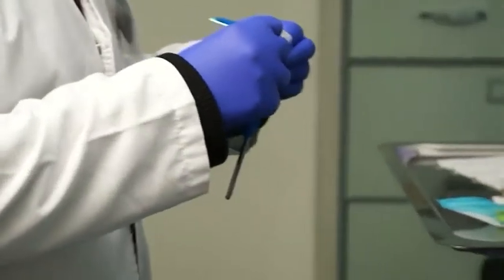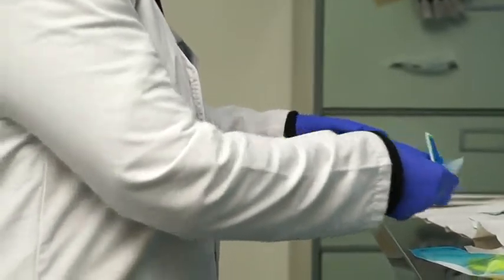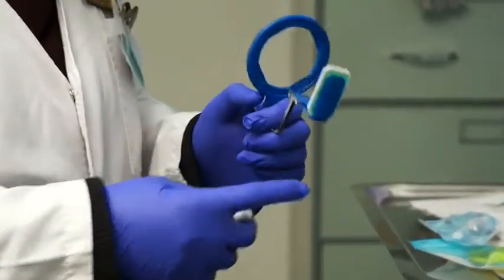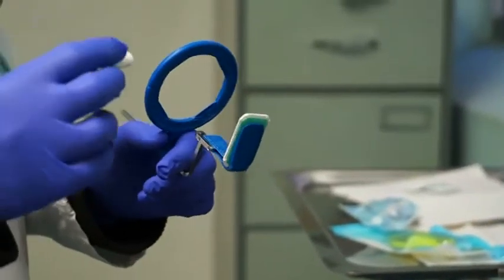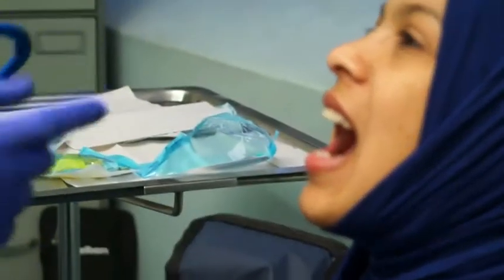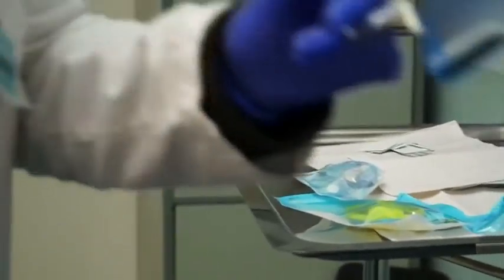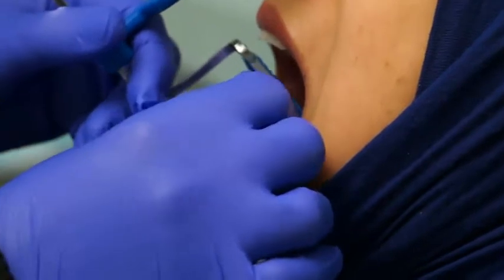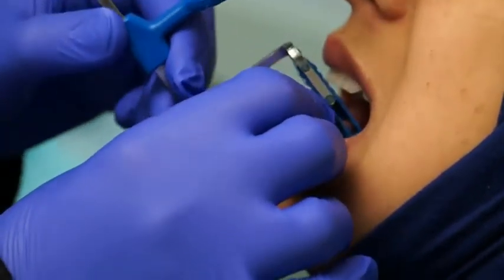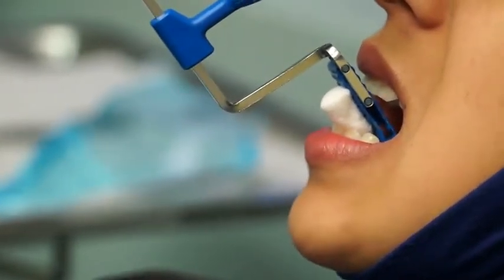Now we have to position this in the patient's mouth. The bite block we usually position on the opposite side, which is just for patient comfort and stability. If we do the maxillary teeth, it's going to be on the mandible. The basic principle says the film should be parallel to the long axis of the tooth, so I can't put the film against the tooth — I have to put it further back into the palate. The patient must then bite on the bite block.